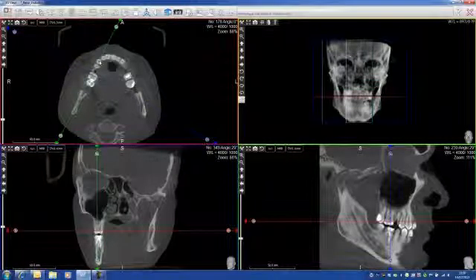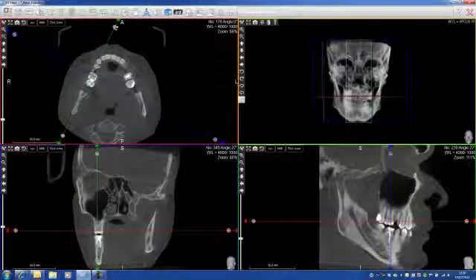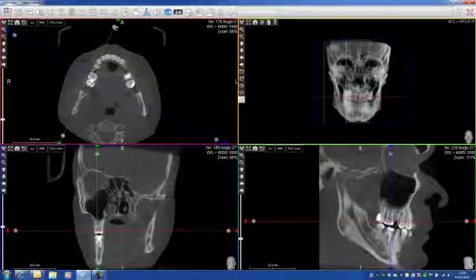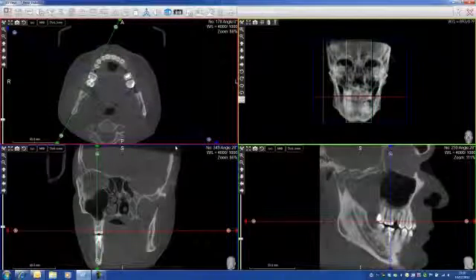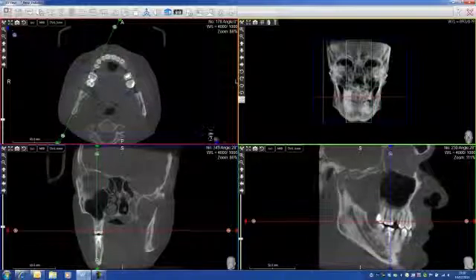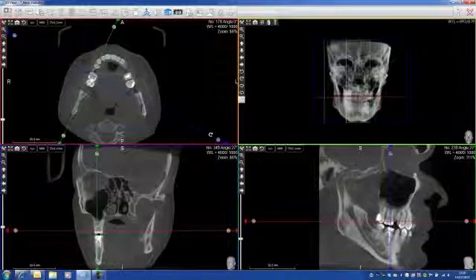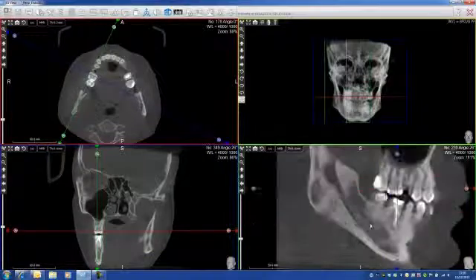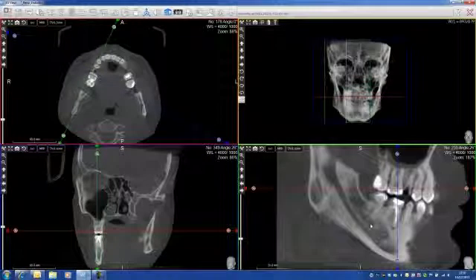Sometimes a little bit of angulation is needed with the green line or the blue line, just here. Here we go. Now I can see it perfectly.